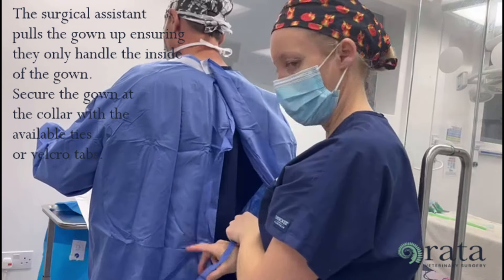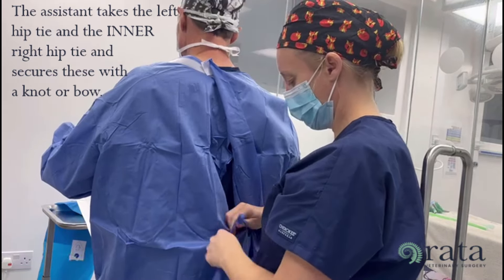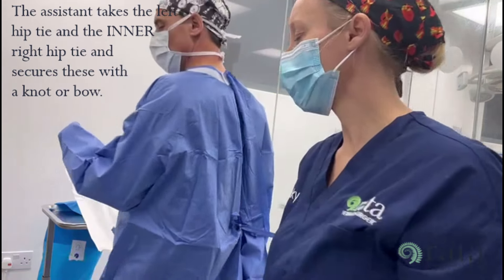Secure the gown at the collar with the available ties or velcro tabs. The assistant takes the left hip tie and the inner right hip tie and secures these with a knot or a bow.